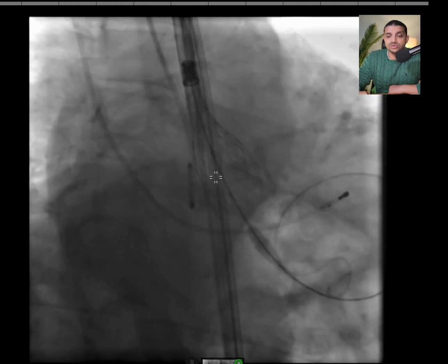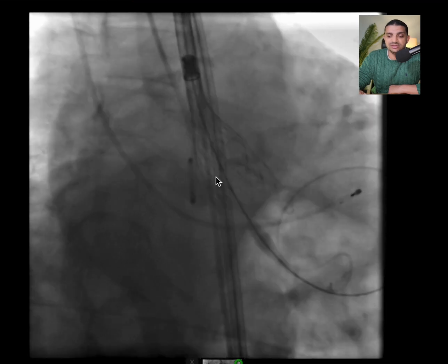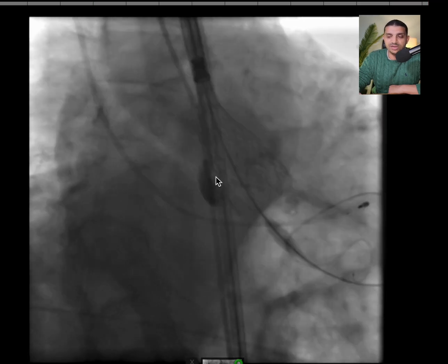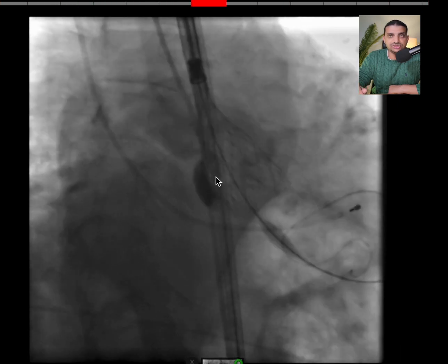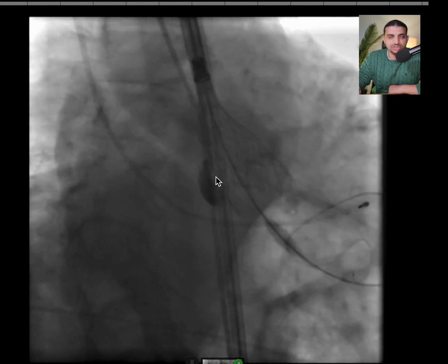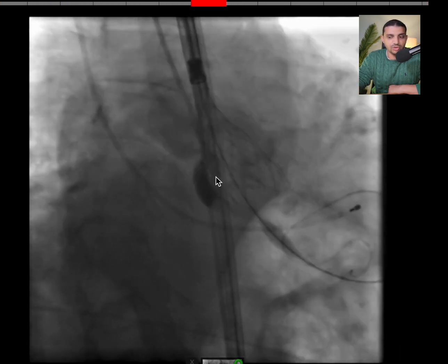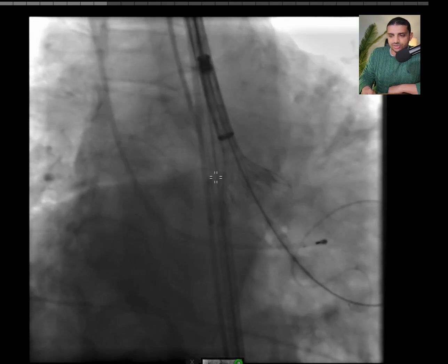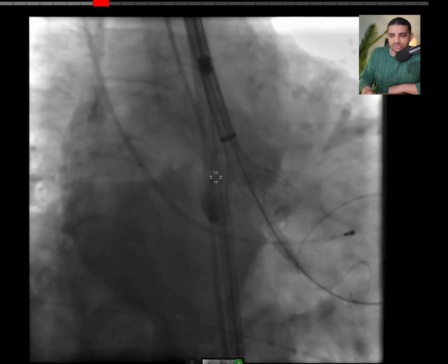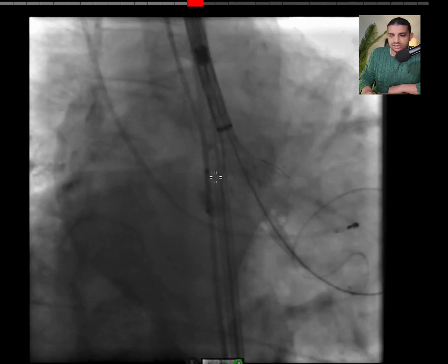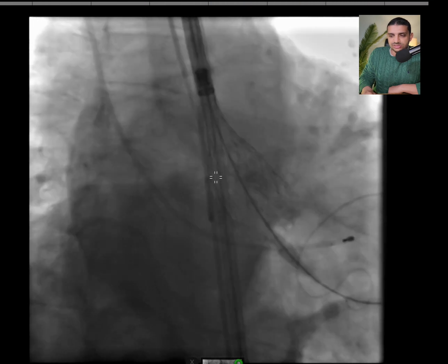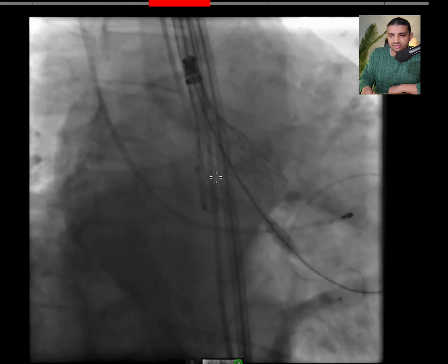What we see here is that there is a deep implantation; however, there is no parallax. I think I need to recapture and try to re-implant at a higher level. I recaptured and started to re-implant again — I went a little bit higher. This is the same view and as you can see, the valve is higher now.